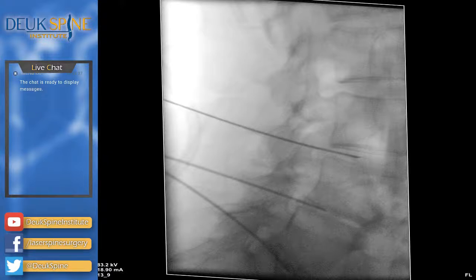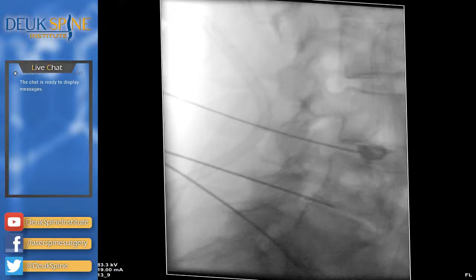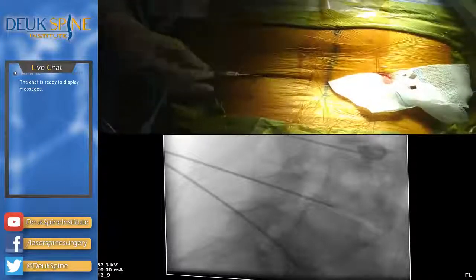Shot. How bad is that? An 8? Do you typically get that pain? Is that typical pain? All right. So 8 out of 10. Interesting. A lot of pressure. Definitely herniated. But I'm not seeing a really well-developed tear. You can go to sleep. Yeah, I'm sorry. So 8 out of 10 at 3-4. I think it's just scarred up. But still painful, obviously.